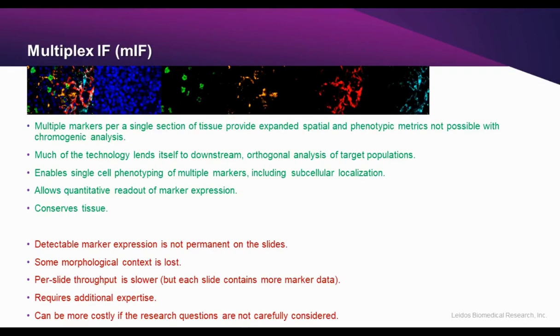Multiplex IF prompts thoughtful experimental design. Due to the cost and the previously mentioned throughput, it is not often practical to run every slide possible and filter the data later. Though cost issues are debatable, since fewer slides are being used overall.